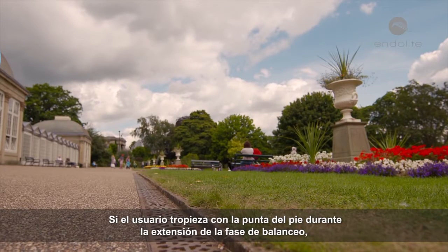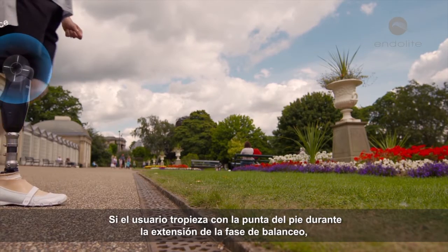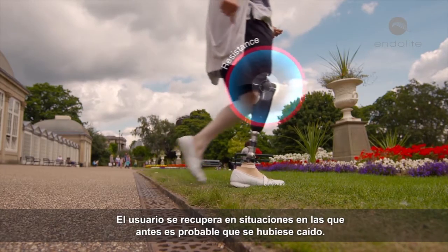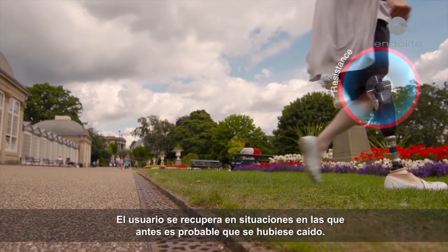Should the user catch the toe during swing phase extension, the hydraulic resistance is enhanced to provide additional knee stability. This allows the user to recover in situations where previously they may well have fallen.